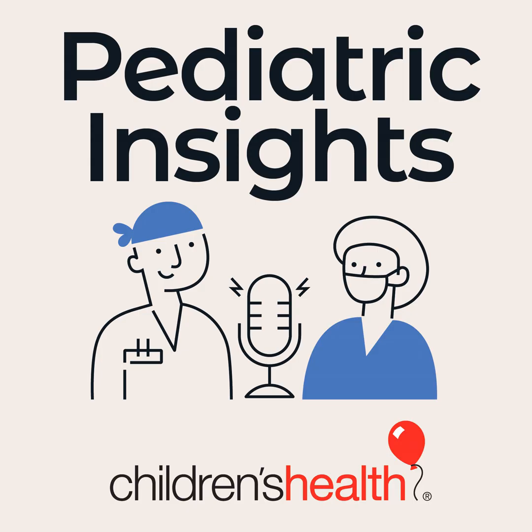In multiple examples, sometimes the imaging with fetal echo or the ultrasound can be limited for a lot of reasons. The fetal position, the body habitus, a lot of reasons can make those images a little bit limited. Fetal cardiac MRI may be able, as we progress with the technology, to actually be an alternative method of imaging. The other aspect where fetal cardiac MRI can really help is in cases of very complex congenital heart disease, and truly for the family and the physicians that are going to take care of that baby with a very significant congenital heart disease, it's really important to make sure that we understand the full spectrum and the full prognosis of that baby.